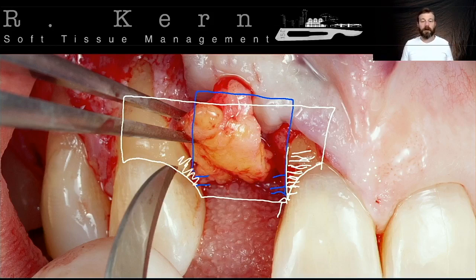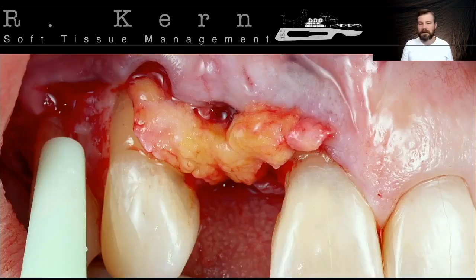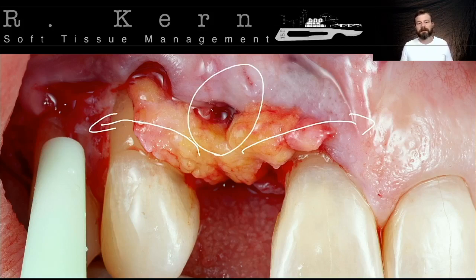So you already saw that there is a difference between the shape of my pedicle and the shape that I need on the recipient area. And there is a trick that we're going to do here, which is splitting the pedicle in half, mesially and distally, like a bifid tongue from a viper. You're going to anchor this area with the suture here, and this area with a suture distally. Ricardo, we're going to lack some of the connective tissue in the center.